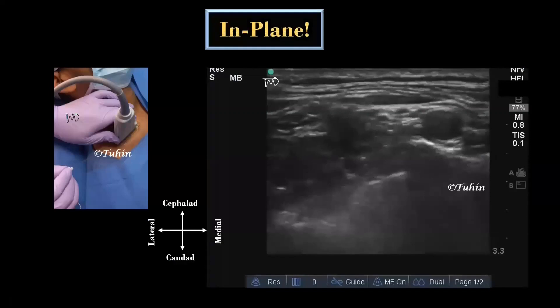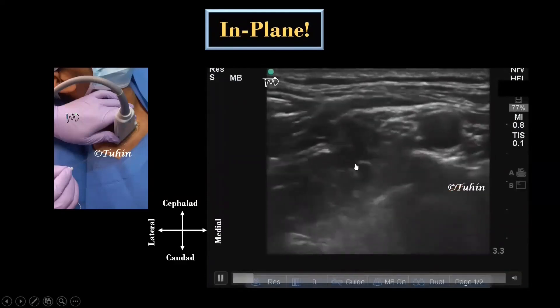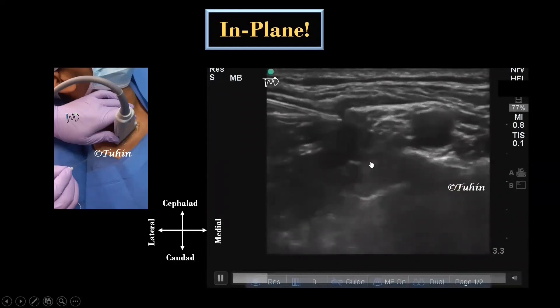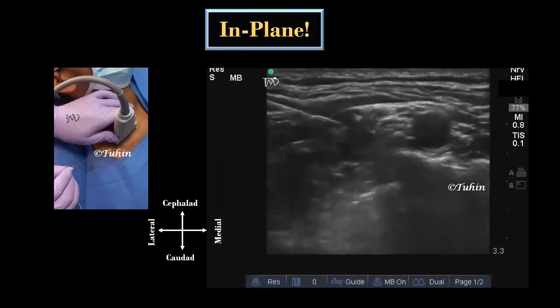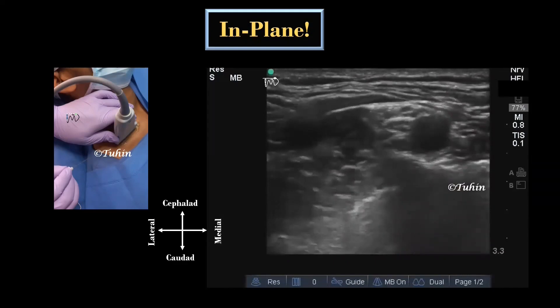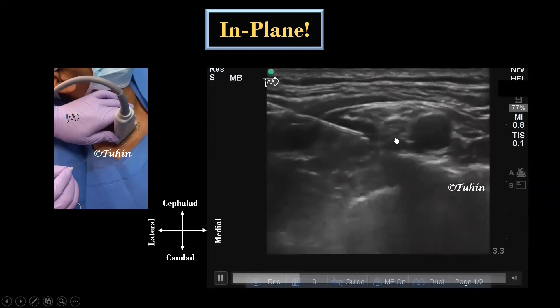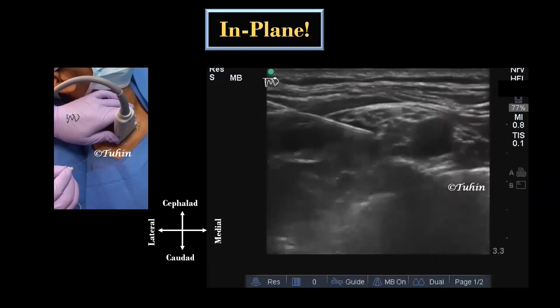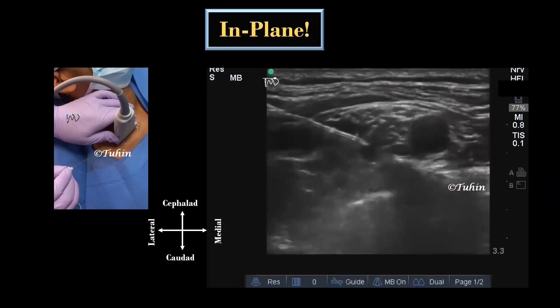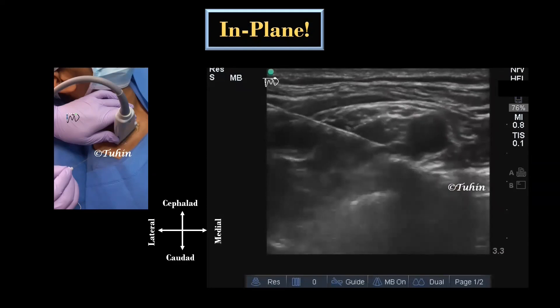After placing the probe in coronal oblique orientation, the nerve block needle is inserted in-plane from lateral to medial direction. The strategy is to use small volumes of local anesthetic for hydrodissection and advance the tip of the needle slowly. Rather than a direct corner-pocket injection, I use the local anesthetic jet to separate the neural elements of the brachial plexus from the sheath and deposit the local anesthetic between the middle and lower trunk first.